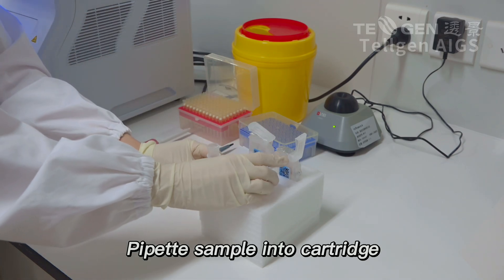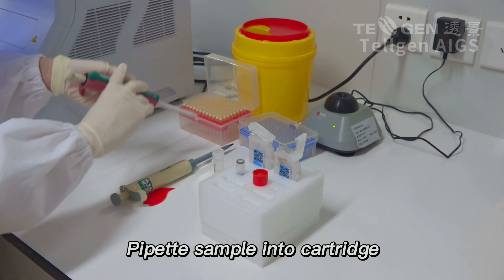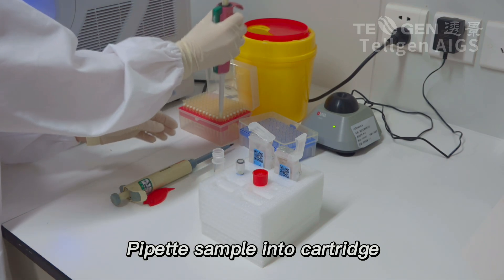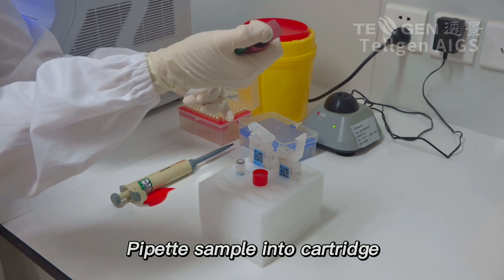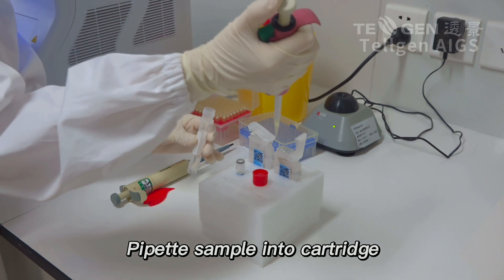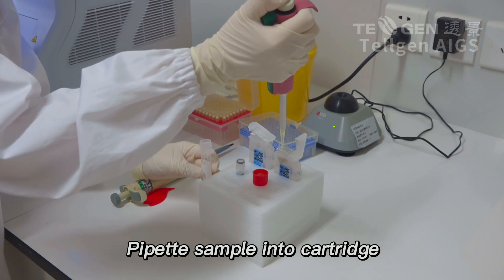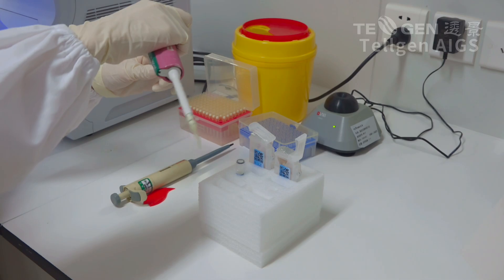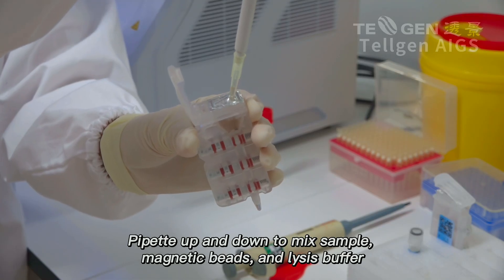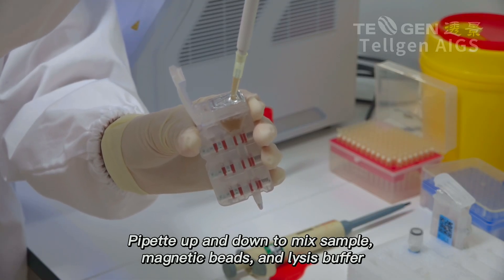Pipette sample into cartridge. Pipette up and down to mix sample, magnetic beads, and lysis buffer.